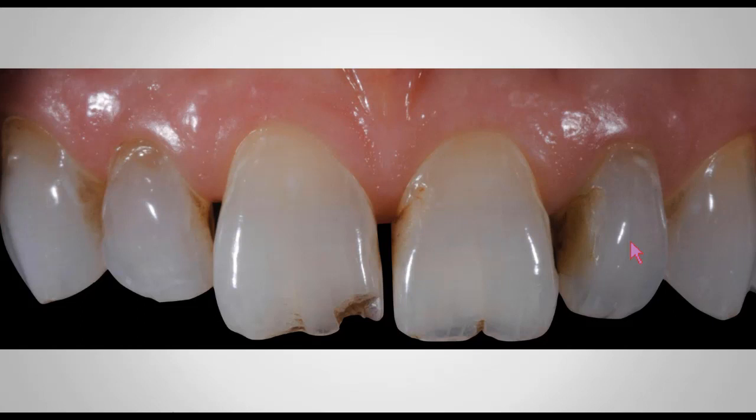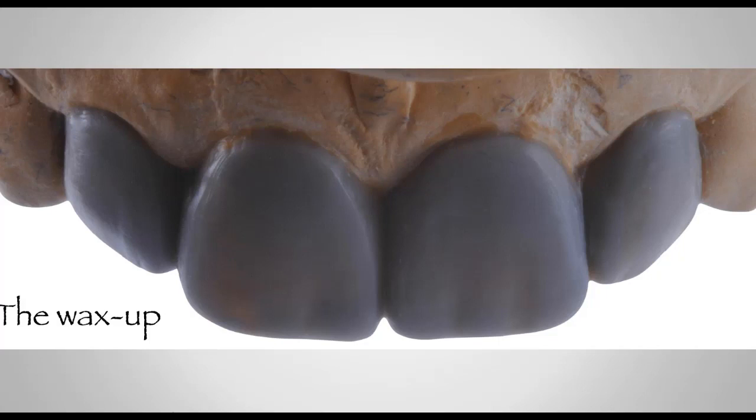By that being said, if you think about it, I am able to add a layer of wax on top of 7, 8, 9, and 10 without having to do anything to the canines, because the facial aspect of these canines is slightly bulkier than the rest of the teeth. I'm able to add a little bit of volume to all other teeth from 7 to 10 and maintain that facial alignment that all these teeth should have in the regular arch. And I'll show you exactly the way it was done.